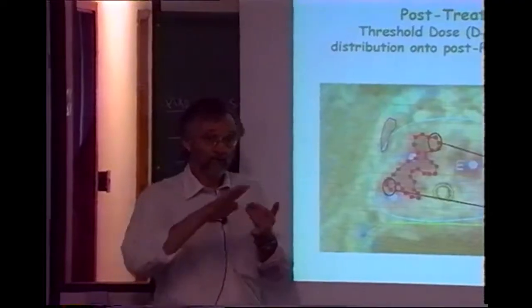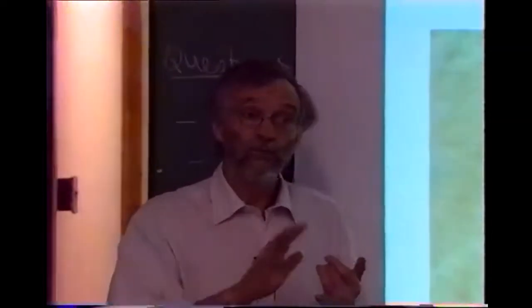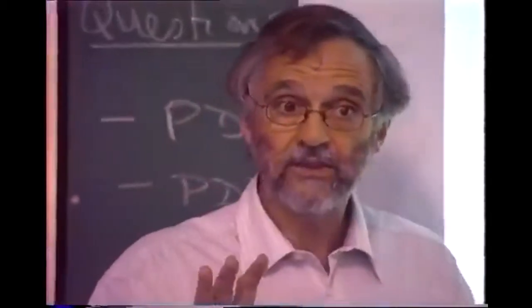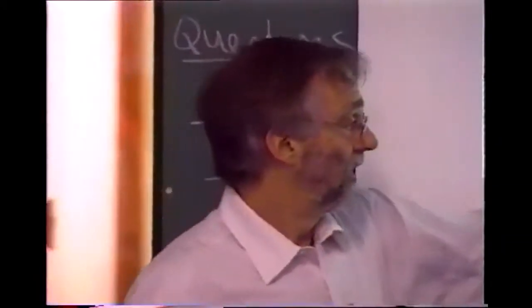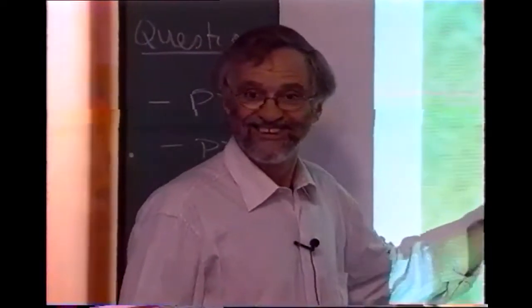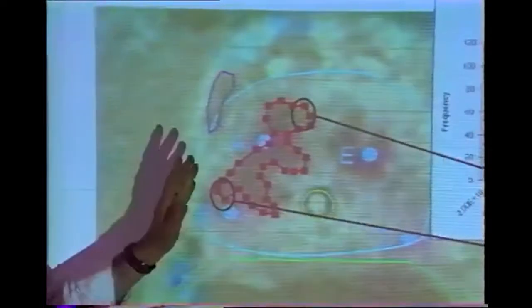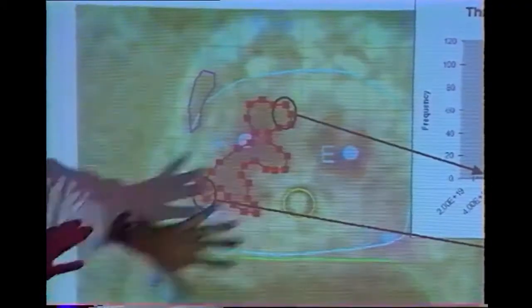It could be variations in drug, it could be variations in oxygen, it could be variations in the cell type. You know, in the prostate there is glandular tissue, there is connective tissue. The most optimistic interpretation would be that this is a tumor and the rest is normal prostate. That's probably not true. But there are a number of factors here.